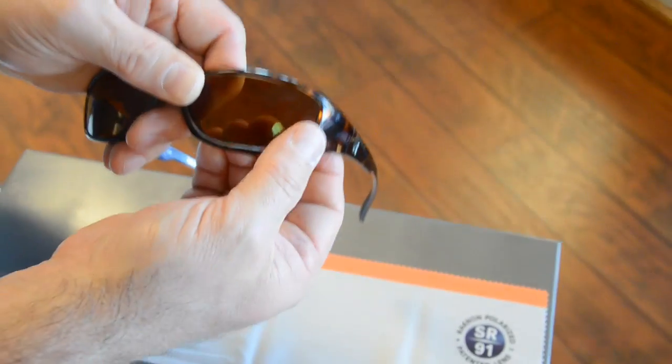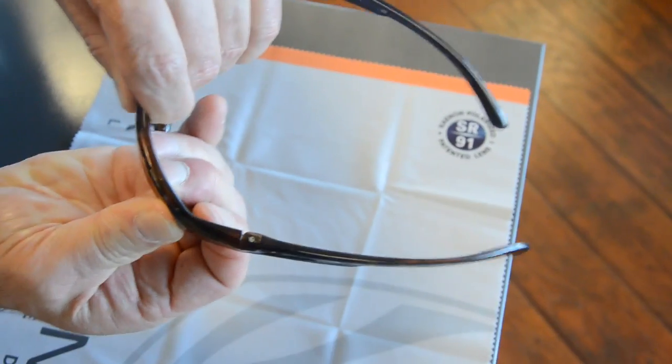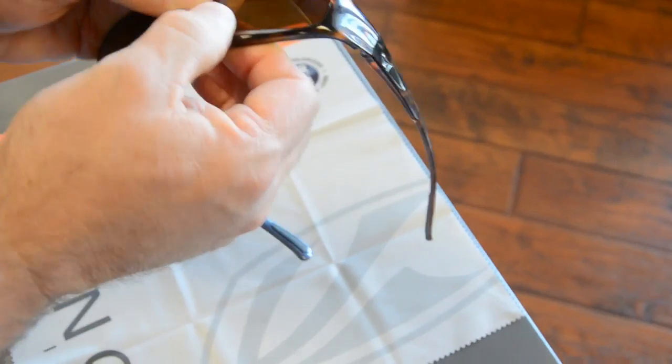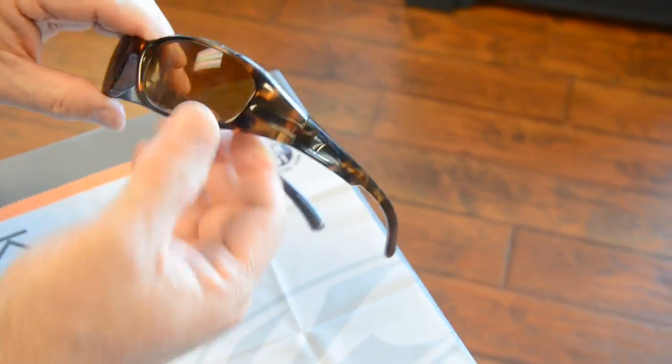We put in one side, then actually bend the lens to put in the other side, and we pop in the bottom. The top popped in by itself.